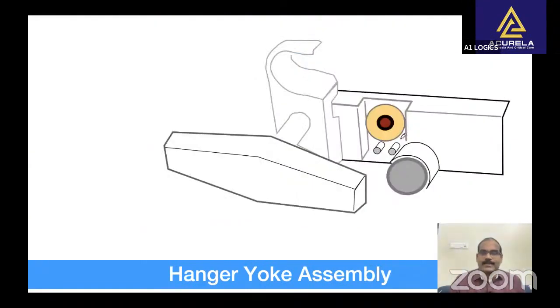Here is the diagrammatic representation of hanger yoke assembly. Let us identify the parts once again. The body, which is the principal framework and supporting structure; the retaining screw, which tightens the cylinder in the yoke; the nipple through which gas enters the machine; the index pins, which prevent attaching an incorrect cylinder; the washer or Bodok seal, which helps to form a seal between the cylinder and the yoke.